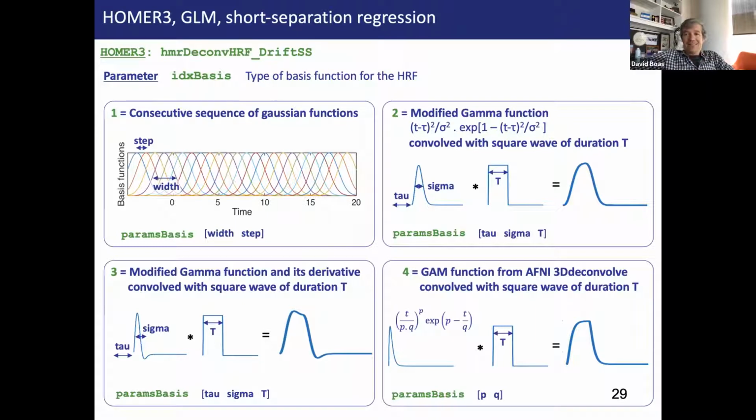And so in those cases, it may be difficult to do drift correction, because depending on how long of a data set you have, your drift correction may actually remove your 1 minute long brain activation pattern, right? So in those cases, you might think about measures of CO2 and blood pressure that you could use as regressors. Or probably what would be easier is maybe a 10-minute experimental design so you could do some low order polynomial drift correction.